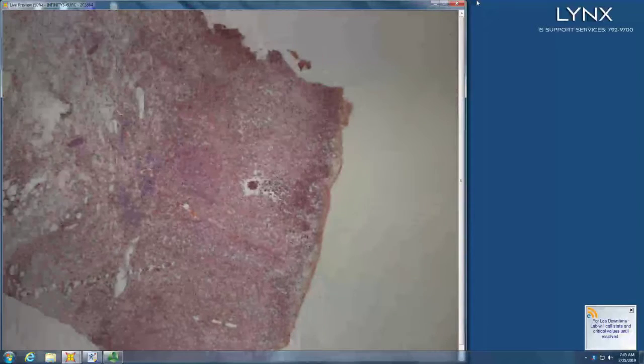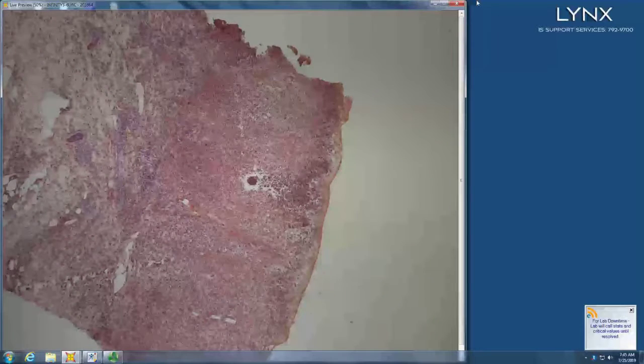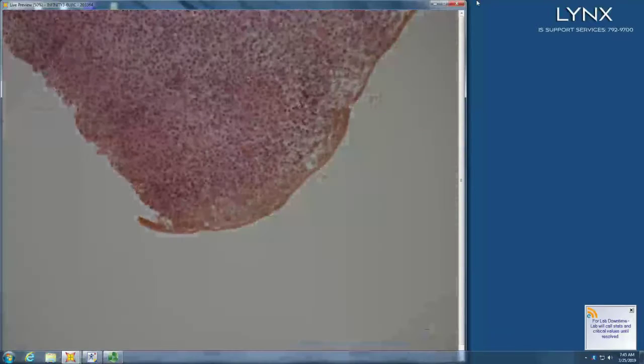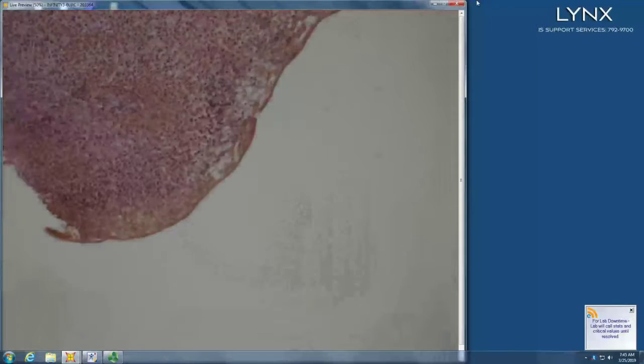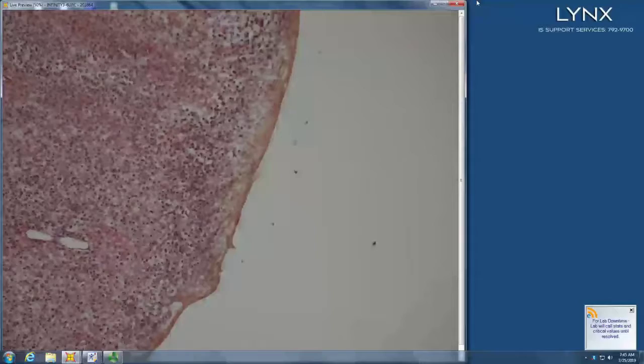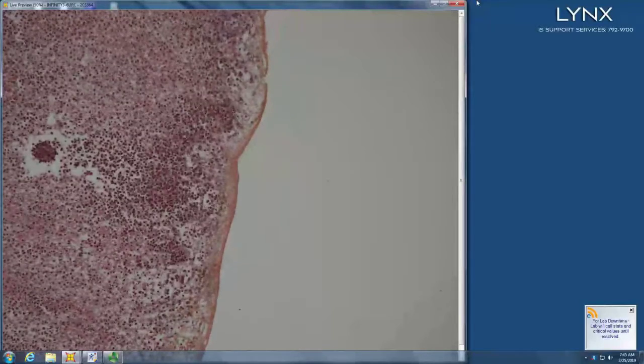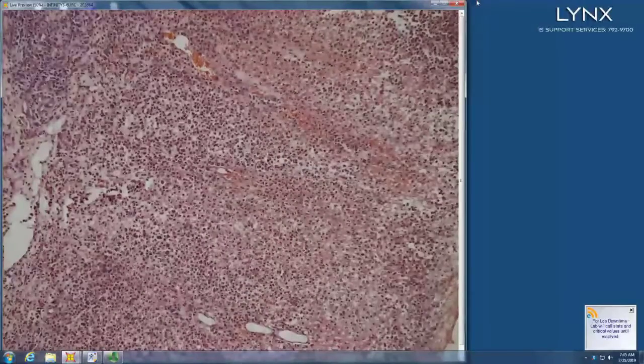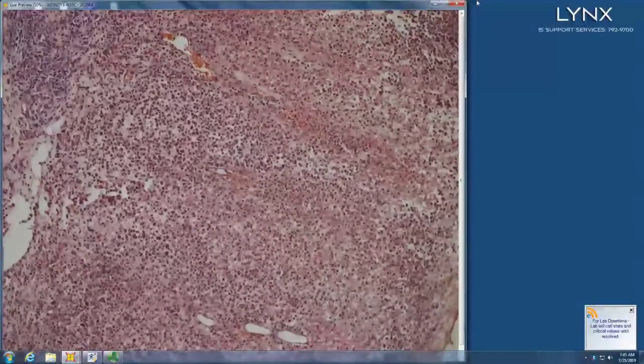And if we saw it earlier in its course, it actually would have started with necrosis of the sebaceous gland, and then necrosis of the rest of the follicle, and then on to necrosis of the dermis. HSV. It's shingles, zoster. Just with the underlying vasculitis, really going to sheets of neutrophils. That's unusual. That would have been tough.